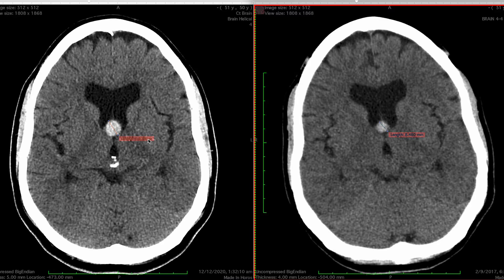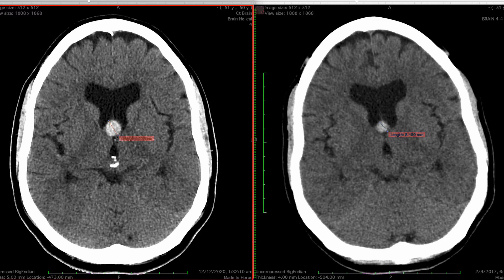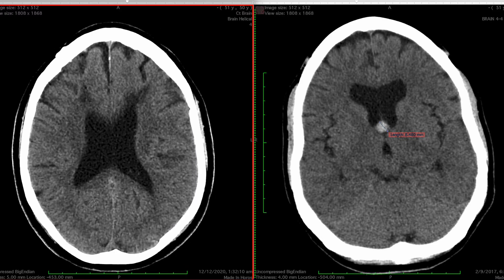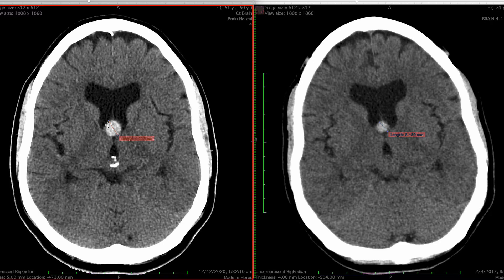You could end the study by saying there is no acute change, but you'd be doing the patient a disservice. Because there is interval growth of the colloid cyst, it's uncertain how big this cyst can get before it causes the patient symptoms. Even though there are no symptoms at this stage and no evidence of obstruction or hydrocephalus, this cyst requires neurosurgical review, as the cyst can get bigger at any stage and we'll never know when the patient may run into issues. The neurosurgeons can drain, aspirate, or resect the cyst completely.